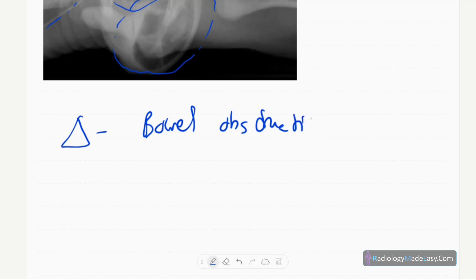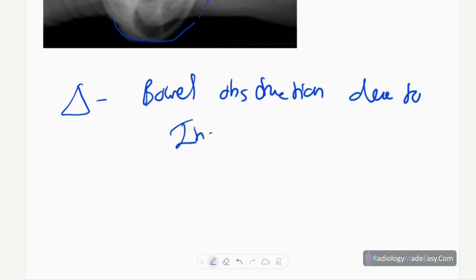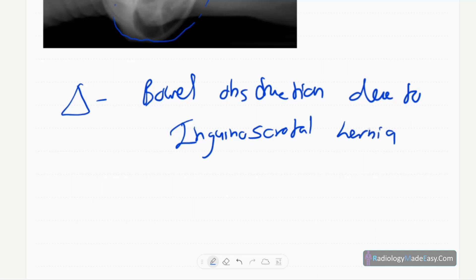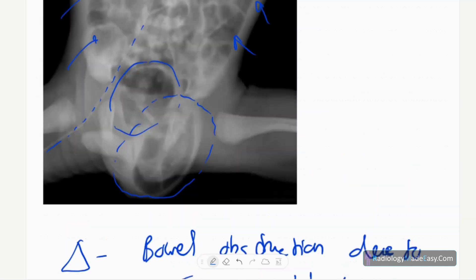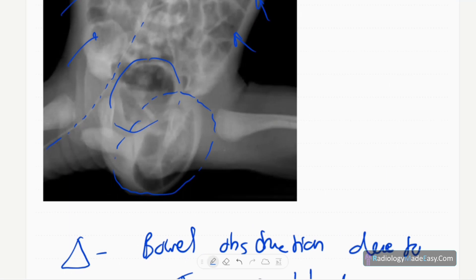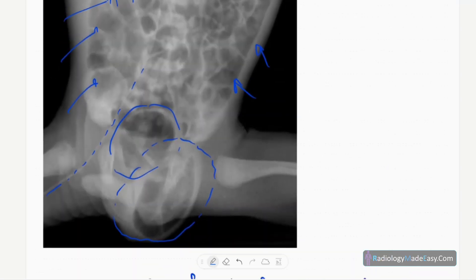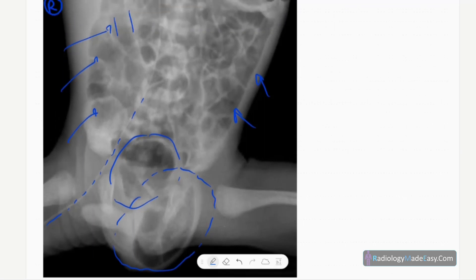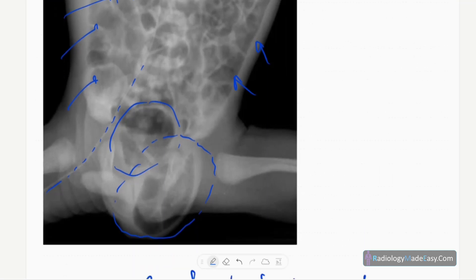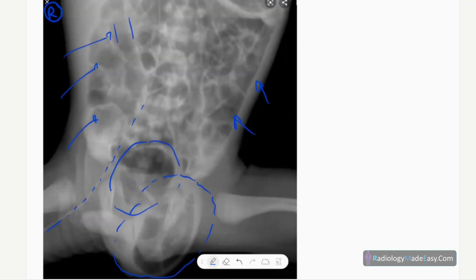The diagnosis is bowel obstruction due to inguinal scrotal hernia. It is very important to look at the structures outside the pelvic cavity. You also have to look for things like gastroschisis and omphalocele, and also abnormal structures in the region of the umbilicus, such as umbilical hernias.